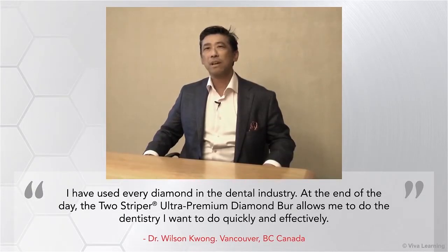I have used every diamond in the dental industry. And at the end of the day, the Two-Striper Diamond allows me to do the dentistry I want to do quickly and effectively.